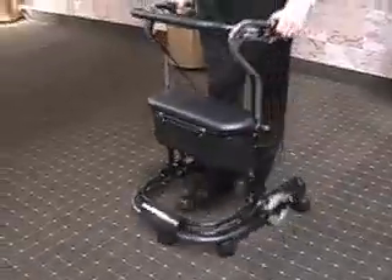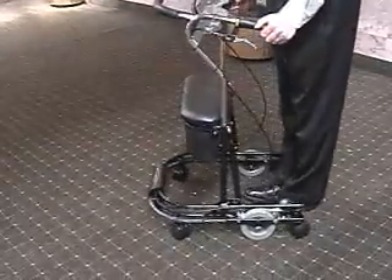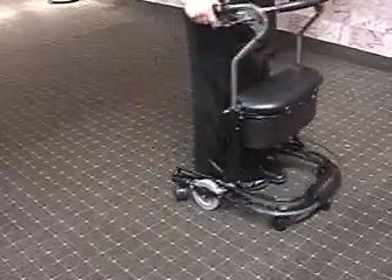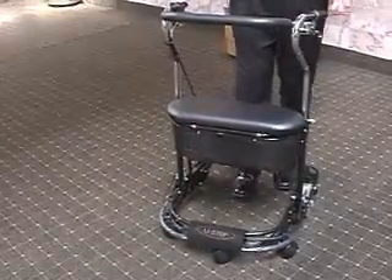In addition, we actually put the main turning wheels — the great wheels — towards the middle of the walker, and the advantage of that is to achieve a very tight turning circle. So it's very functional for tight spaces such as indoor spaces like in a home, like a hallway or a kitchen.